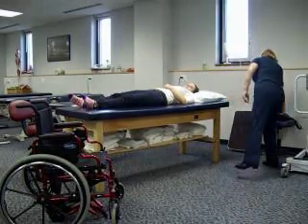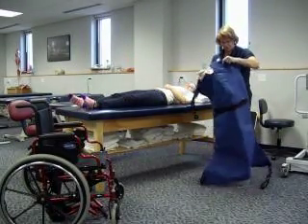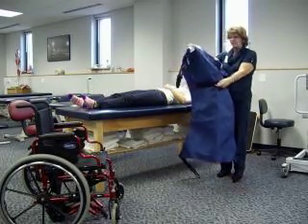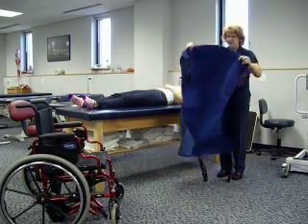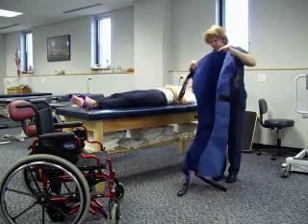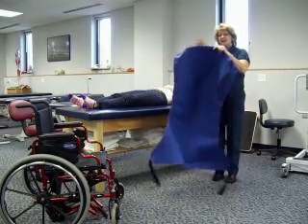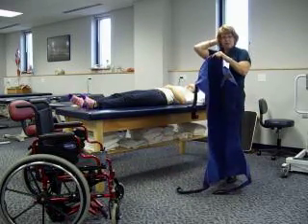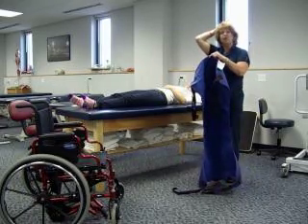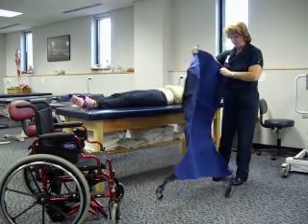We're going to be using the solid sling. You can see there's one side that has the tags and some little handles — that's going to be away from the patient. The side toward the patient shouldn't have any of that. You can see the top part is rounded and the bottom part is very straight across. The straight part goes down by the knees. The top rounded part should be up past the occiput — the occipital protuberance — in order to help support the head once the patient is upright in the sling.